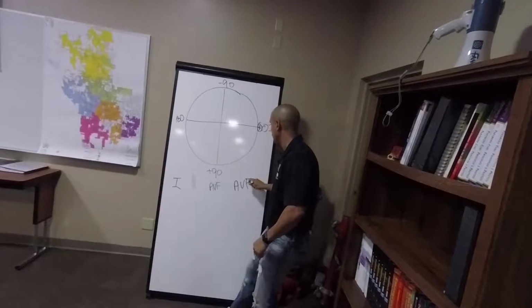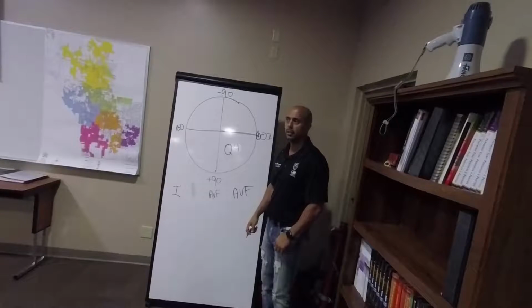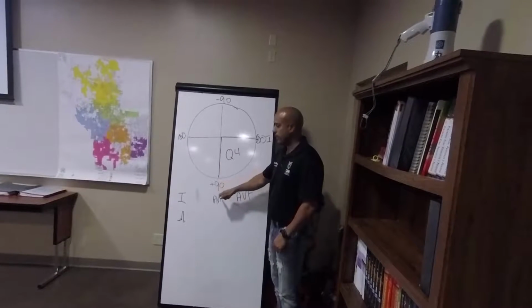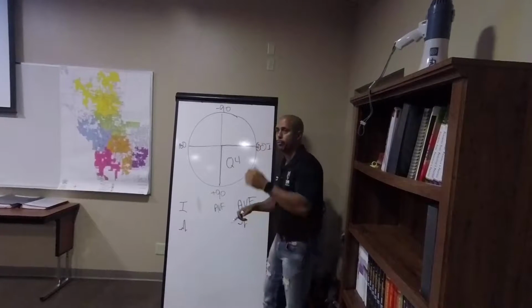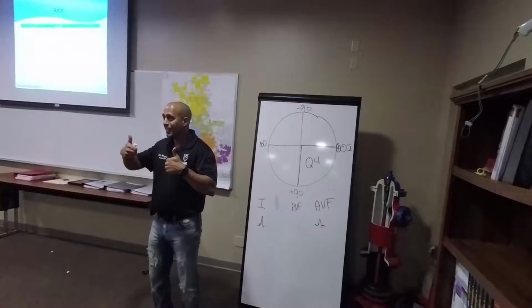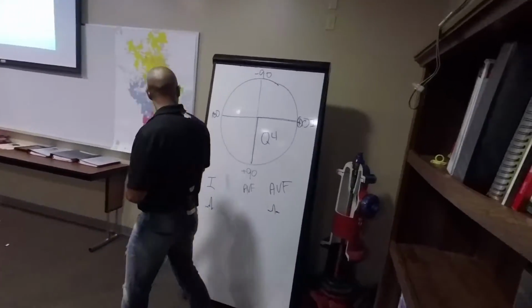So if I use lead 1, and we're going to put it on the other side, AVF, right? So let's talk about normal axis, quad 4. What should lead 1 be, negative or positive? Positive, right? So my deflection is going to be upright, right? What should my other line be? AVF should be negative or positive? Positive. Upward deflection. Maybe that's not the best looking upward deflection, but upward. Look, normal axis is good. Lead 1, AVF, both what? Upright. Thumbs up, good axis.